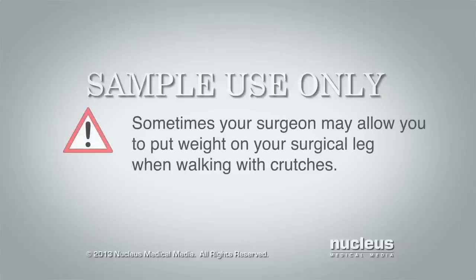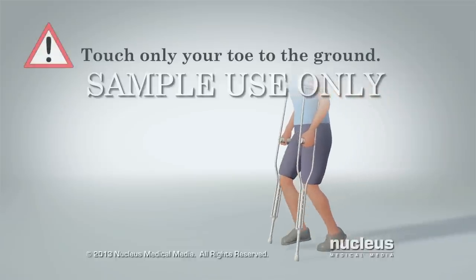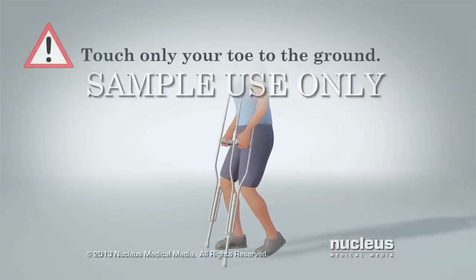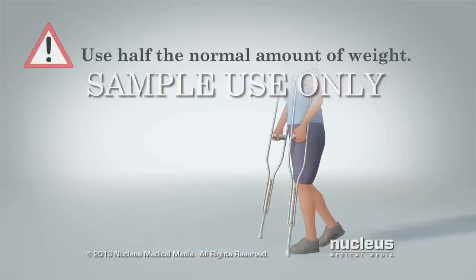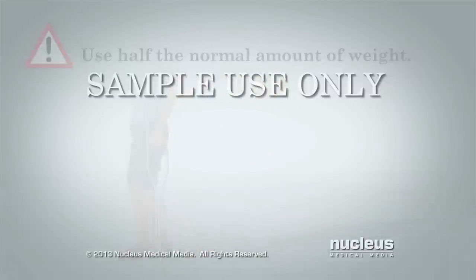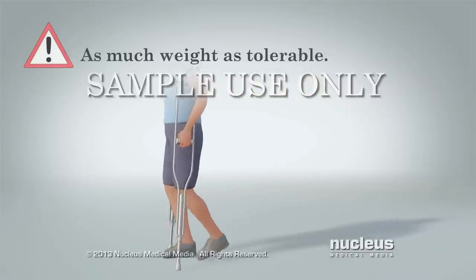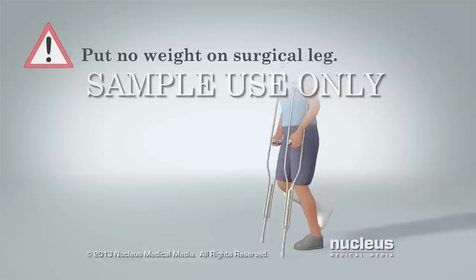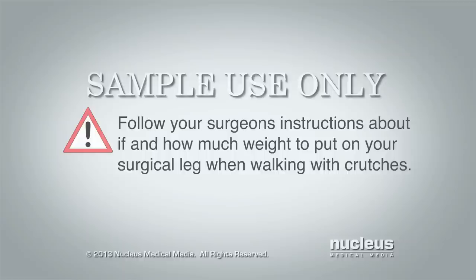Sometimes your surgeon may allow you to put weight on your surgical leg when walking with crutches. You may be instructed to touch only your toe to the ground for balance but not put any weight on it, put half of the weight that you normally do when you walk, or put as much weight on your surgical leg as you can tolerate — or not put any weight on your leg at all. Be sure to follow your surgeon's instructions about if and how much weight to put on your surgical leg when walking with crutches.